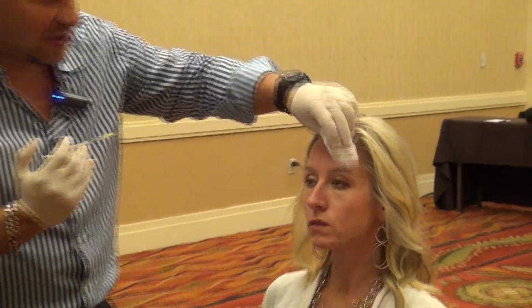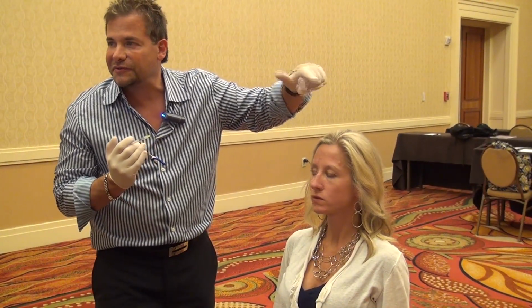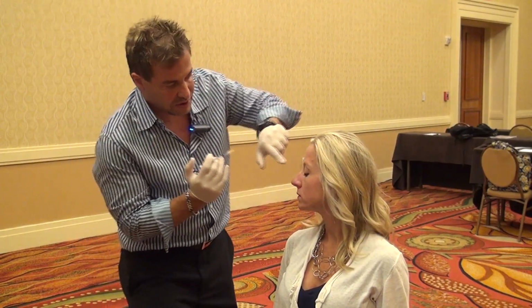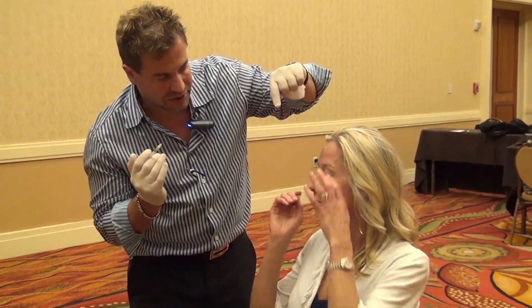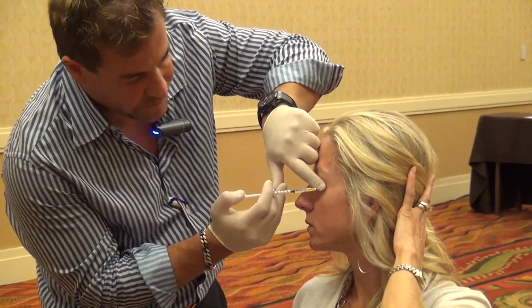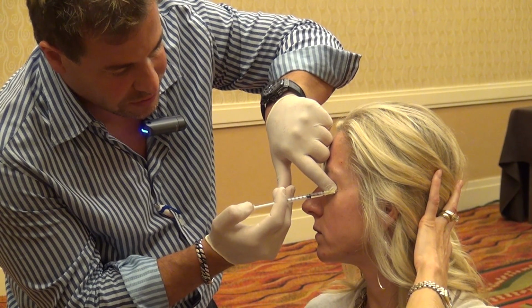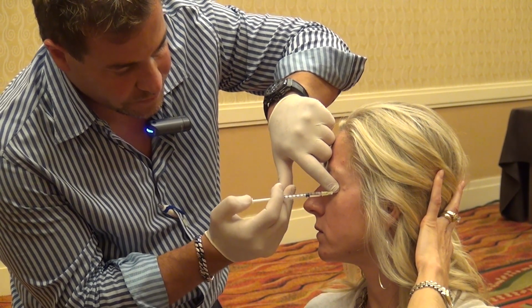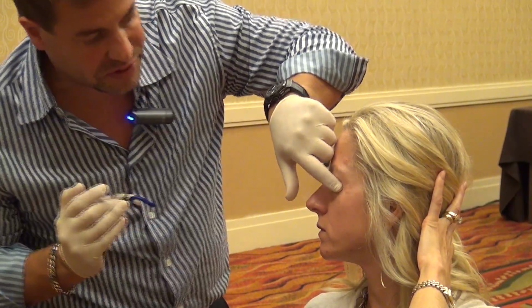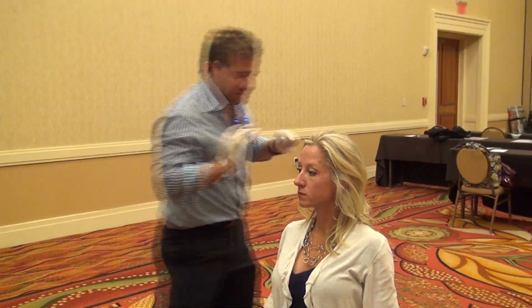Okay, good. Now, let me show you how to do the lateral areas. I left a couple areas up here if somebody else wants to do that. But let's turn over here like this. Now, can you bring your hair back gently? Perfect, thank you. So now, we're going to go over here, if everybody can see that okay, and just real gently like this. There we go. I only did 2. You can do a lot more than that, but I just did 2 for the sake of this.